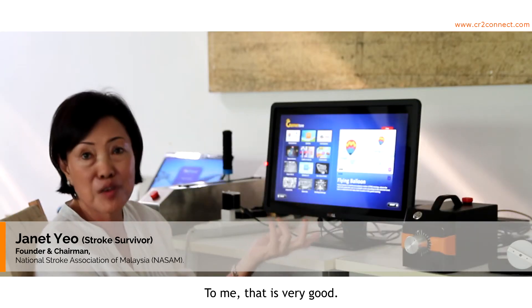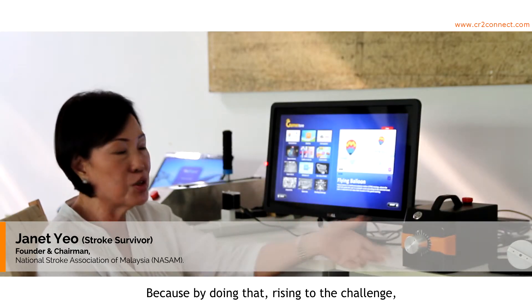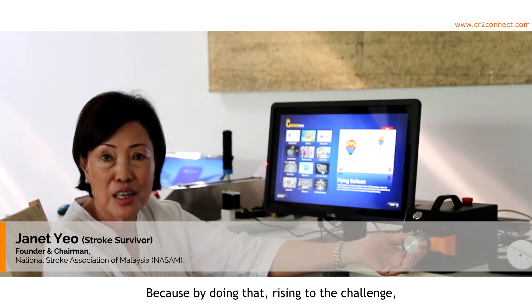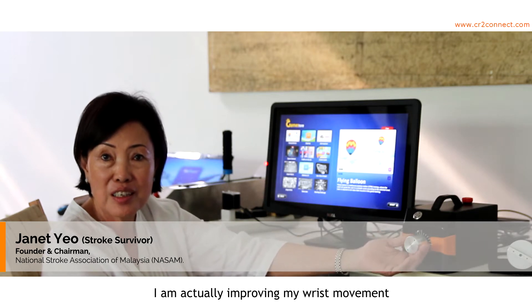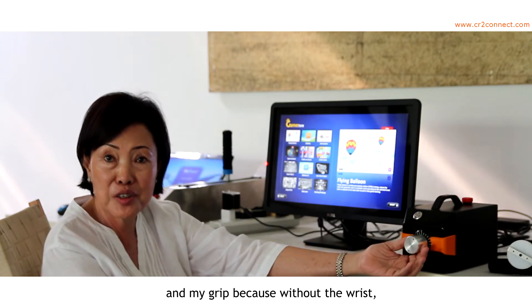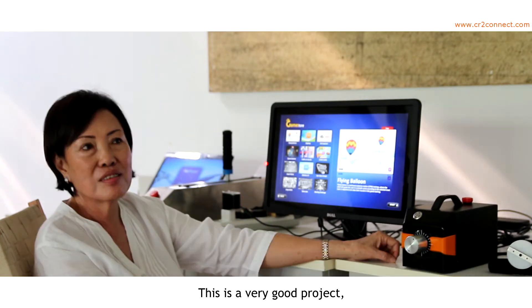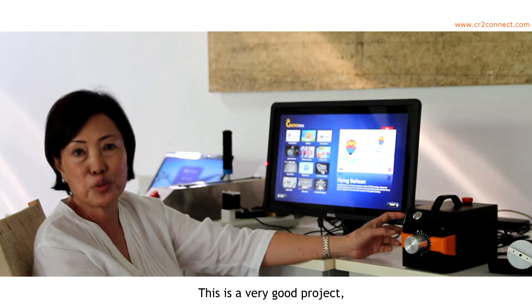To me, that is very good because by doing that — rising to the challenge — I am actually improving my wrist movement and my grip. Because without the wrist, without the grip, I cannot catch the raindrop. This is a very good project.